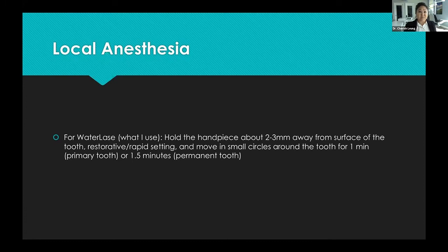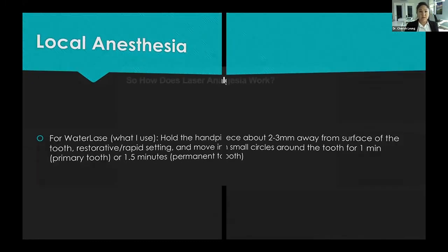I find that it lasts for me about 10 to 15 minutes, depending on each kiddo. But in my practice we work super fast, so usually that's good enough for a procedure. And I really only need to do that if I'm doing an adult tooth, or a pulpotomy on a deciduous tooth.